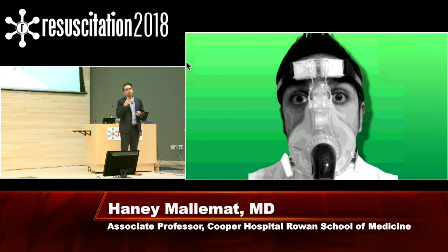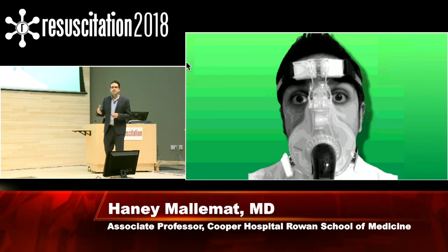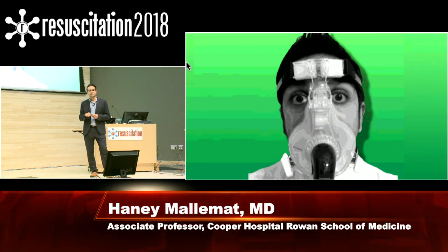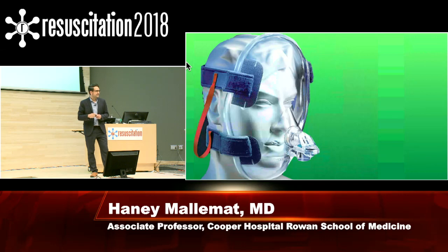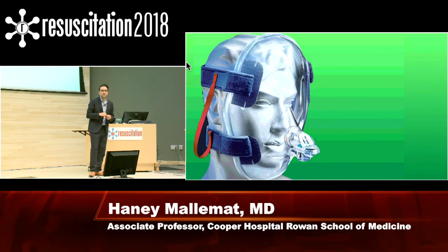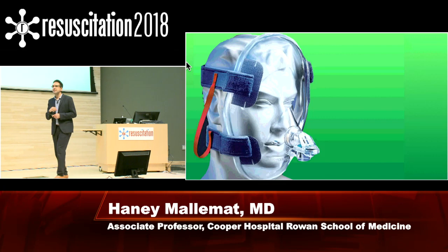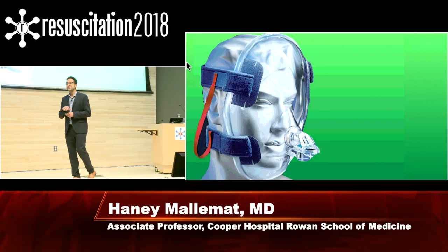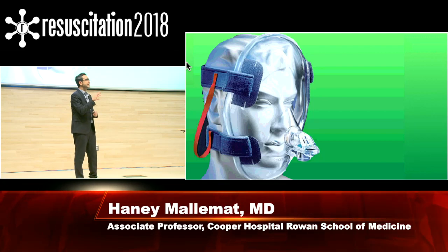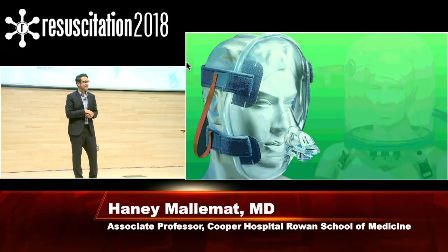And what they've realized is that maybe we need to go to other sorts of interfaces for patients who are getting this non-invasive ventilation. So this is another device they've come up with that distributes the force around the face so there's not that one point of pressure causing septal necrosis. So this is an alternative to using that tight-fitting mask or that nasal CPAP that you sometimes see. Now there's even something newer than that that's been on the market in Europe for a while, but has now come to the States, and that's this thing.